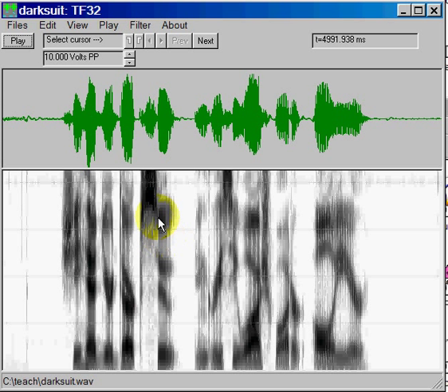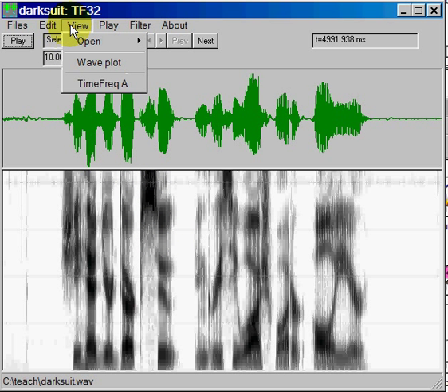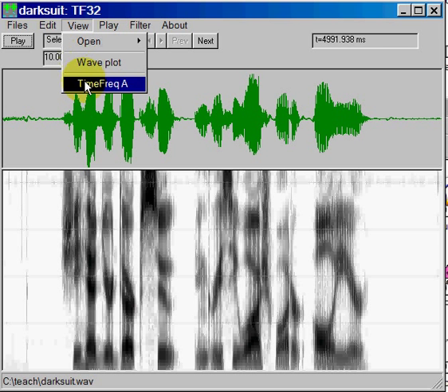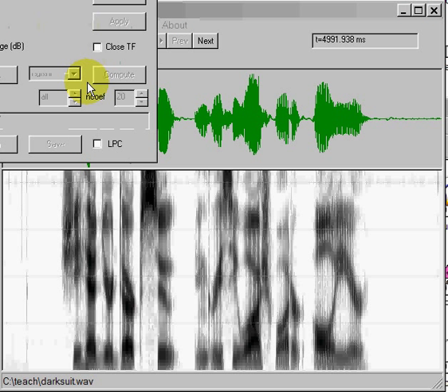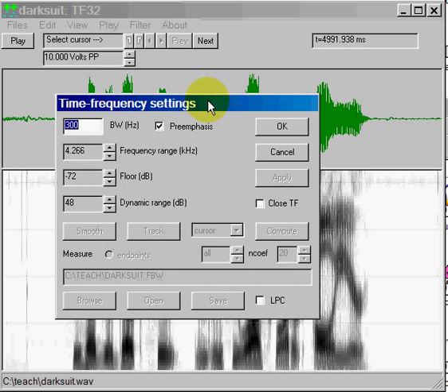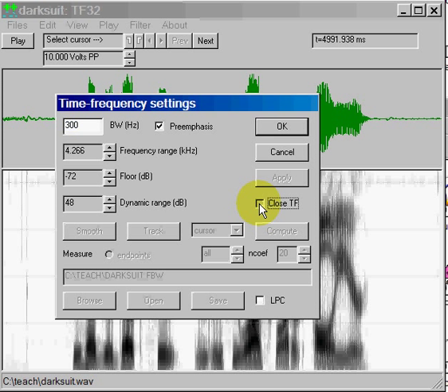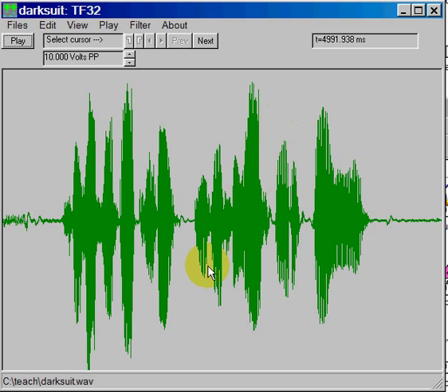To do that, I go to the View portion of the menu and click on Time Frequency, which refers to the spectrogram. You'll get a window that looks like this. I will mark the box that says Close TF, hit OK, and now we're down to a single display.